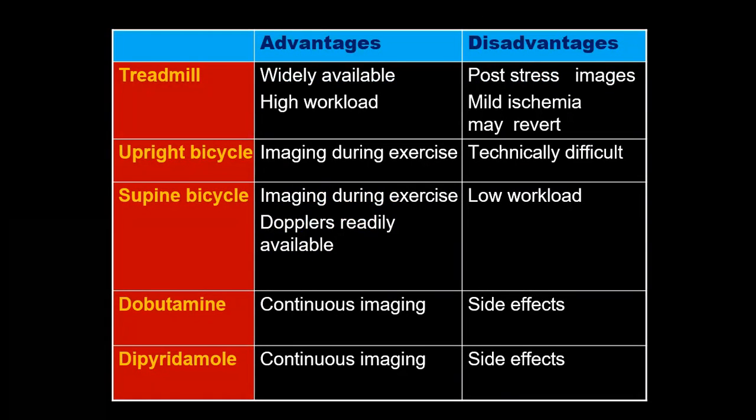So these are some advantages and disadvantages of the stress echocardiography. You know, there is treadmill, upright bicycle, supine bicycle, dobutamine, dipyridamole, etc.